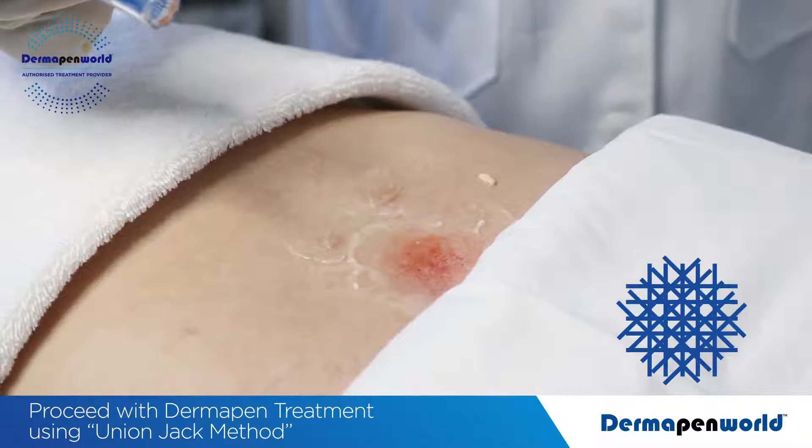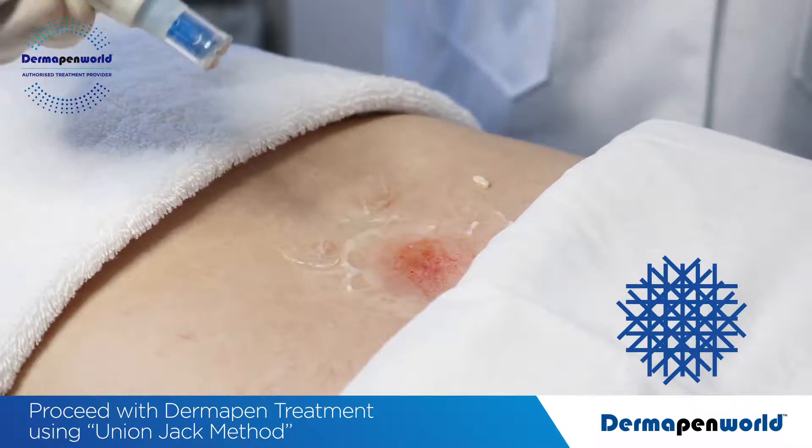If a multi-pass is required, this is not problematic. We see our visual endpoint of blood.